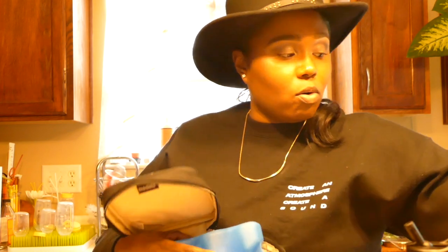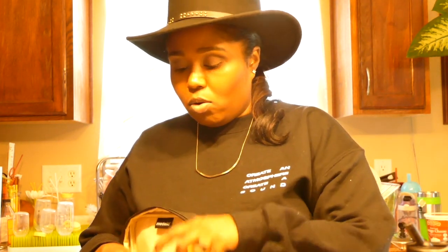And with my milk that I pump in the middle of the night, because I'm not coming downstairs to put it in the refrigerator or the freezer, I also go to bed with a mini cooler that came with the pump as well. So in here it's just an insulated cooler, and then it comes with an ice block as well. And basically you put it in here and it holds, I'll show you, it holds 4 bottles. So two on that side and then 2 on this side.